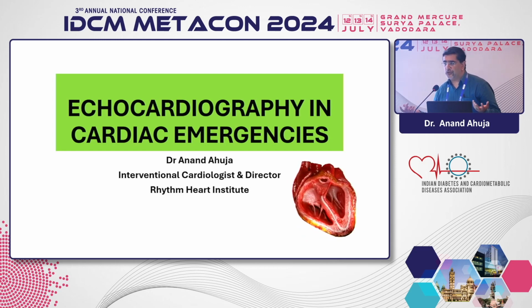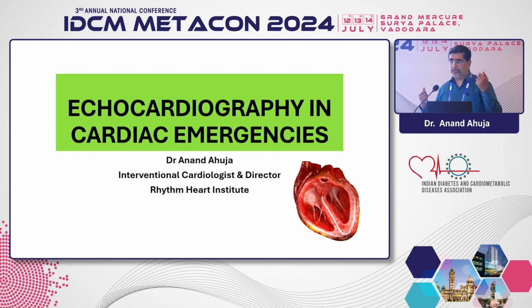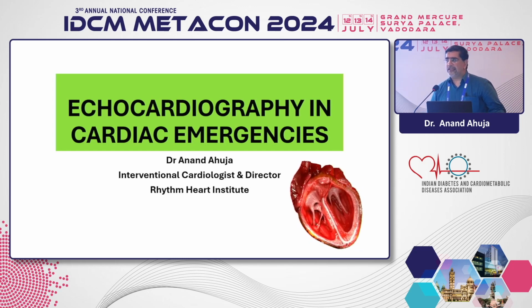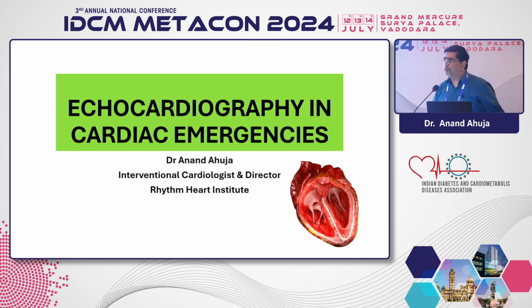And when and where should you do this? It should be done at the bedside wherever it is possible, be it the ICU or the cath lab or the ER or the OT. And it should be done as promptly as the earliest sign of suspicion that there's something wrong going on with the heart. Take up a probe, put it, quickly see, and if it is changing a line of treatment, be prompt to do that.